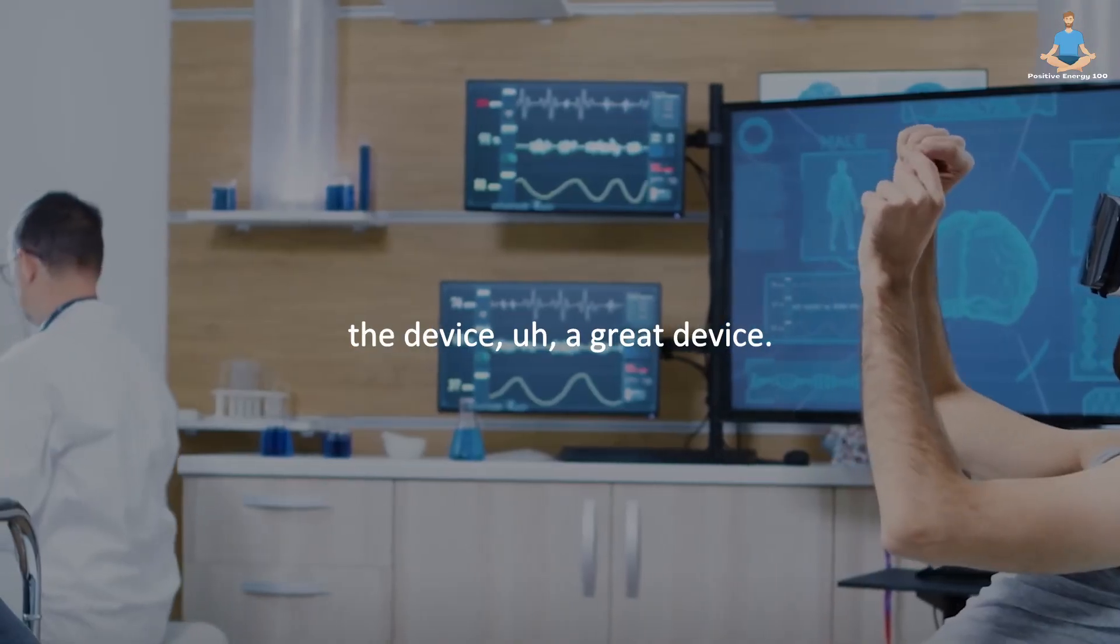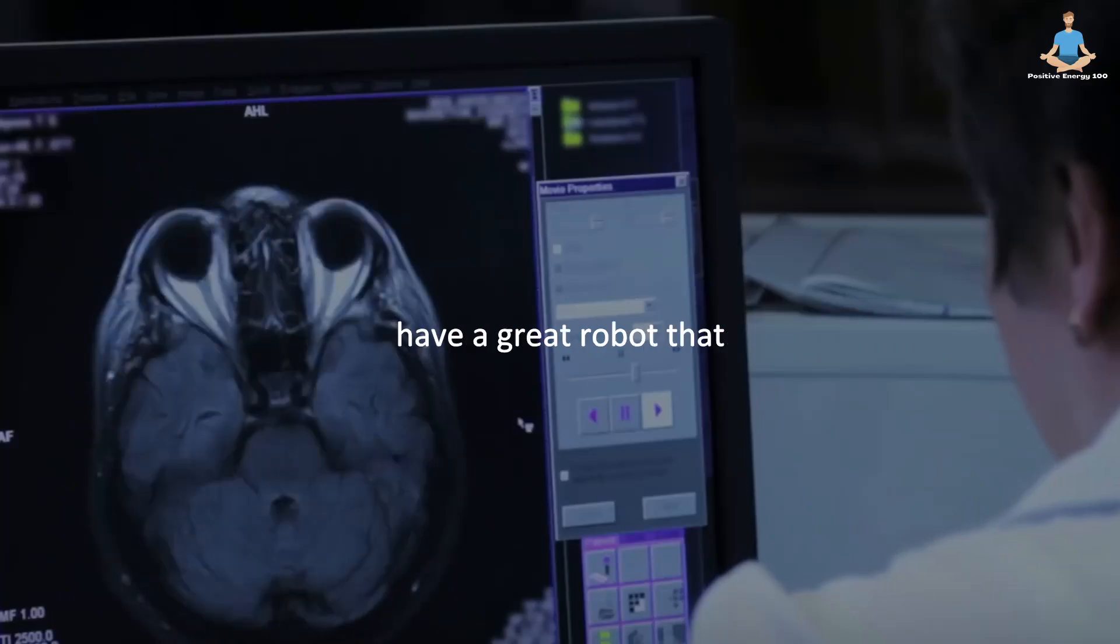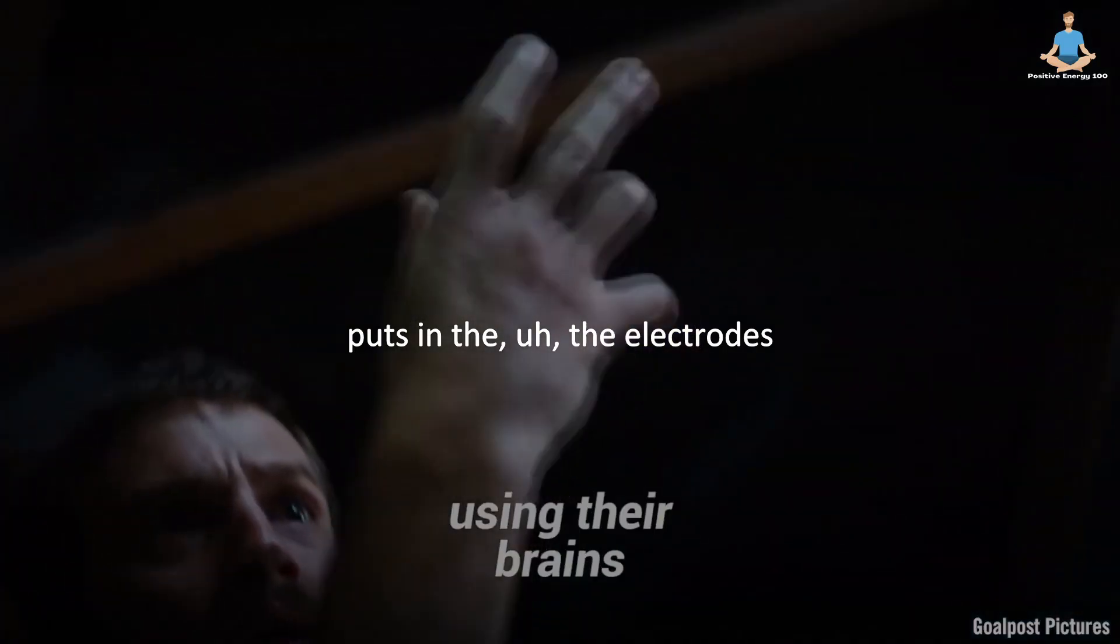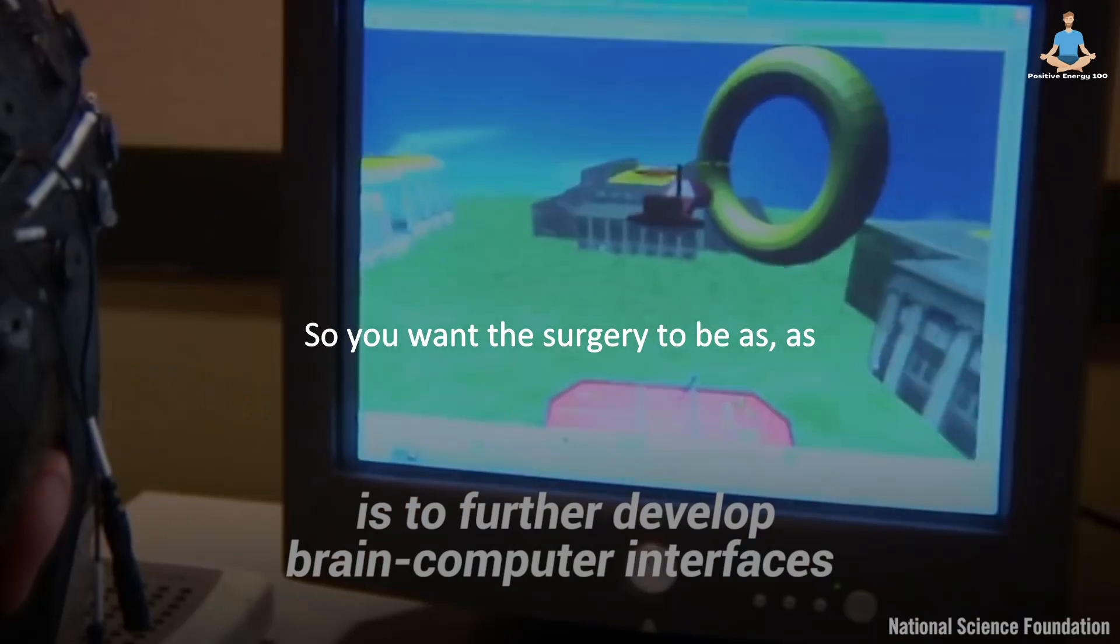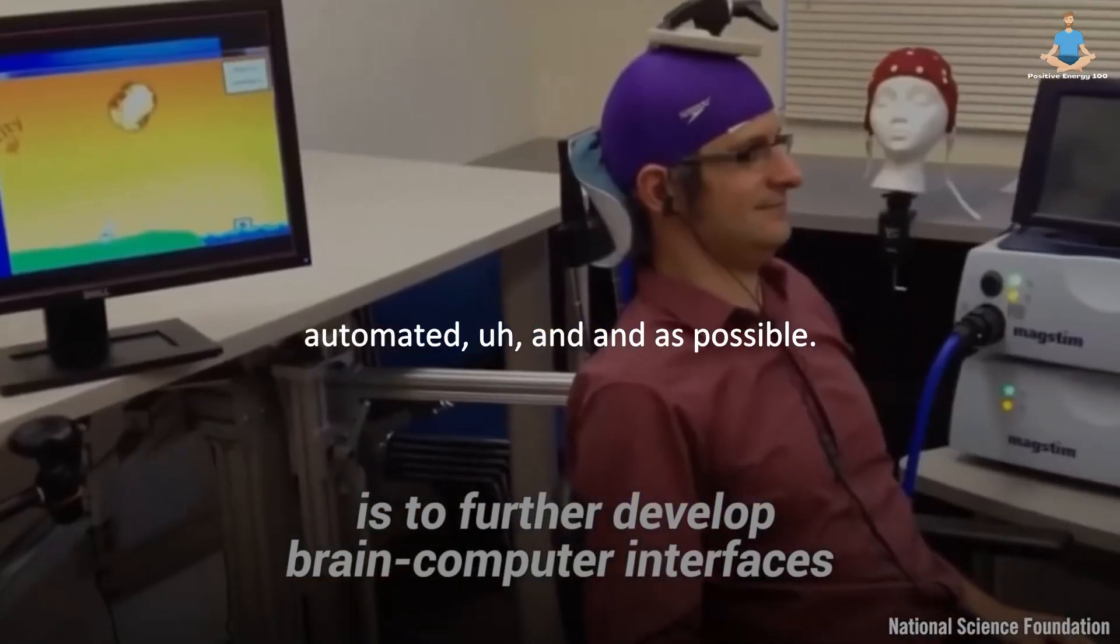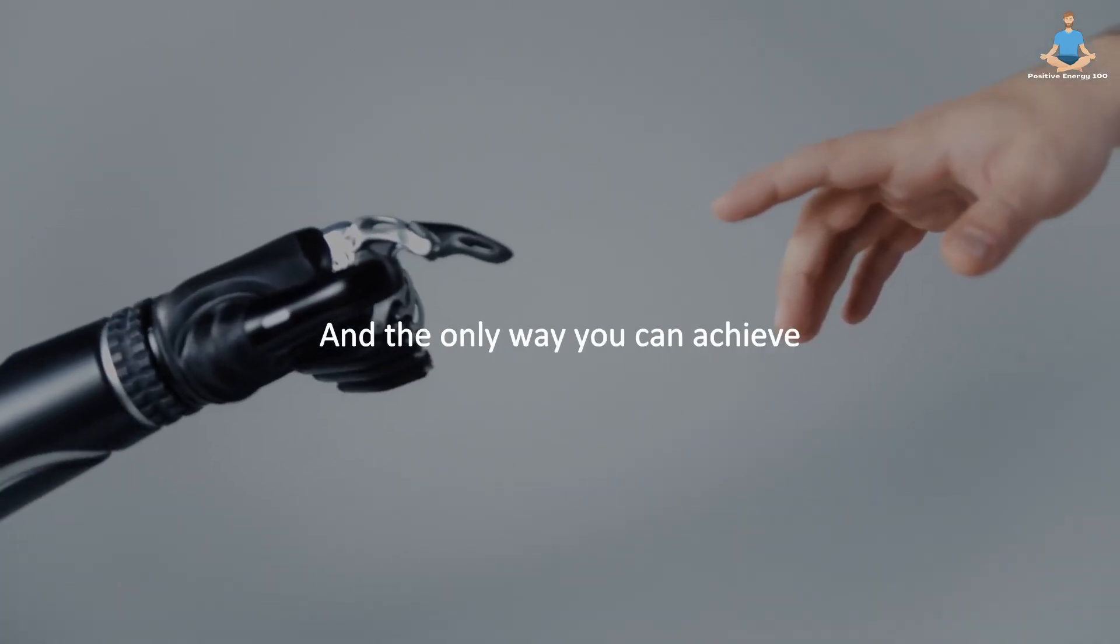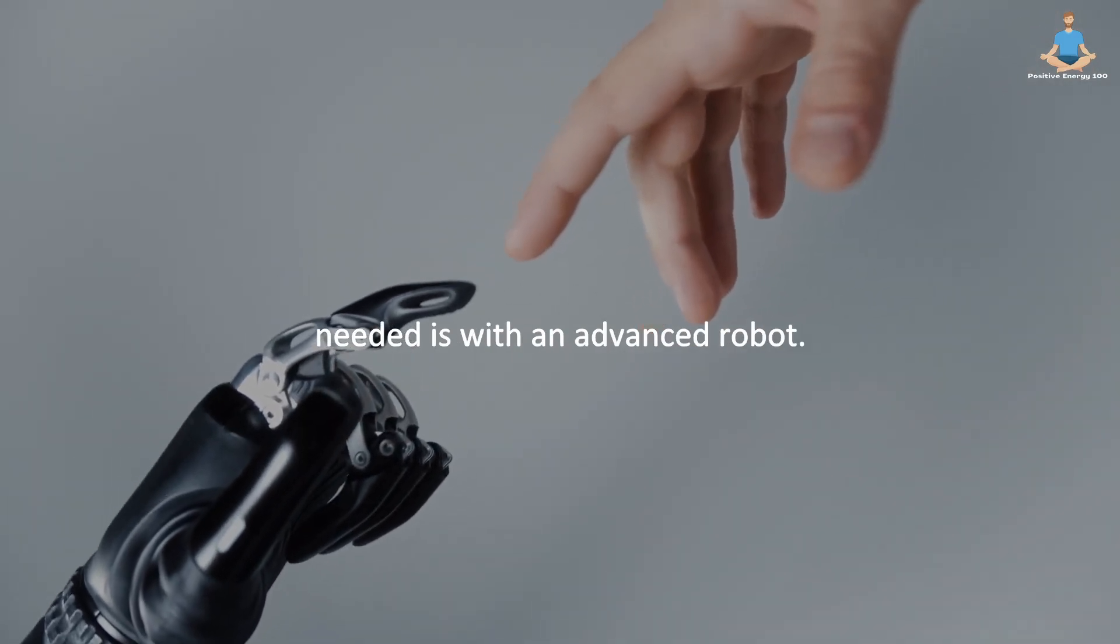You need to have a great device, and you also need to have a great robot that puts in the electrodes and does the surgery. So you want the surgery to be as automated as possible. And the only way you can achieve the level of precision that's needed is with an advanced robot.